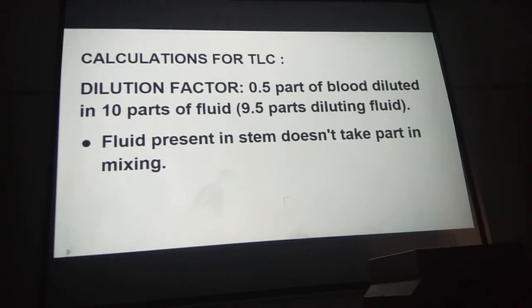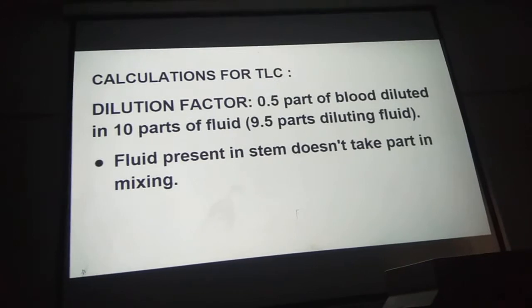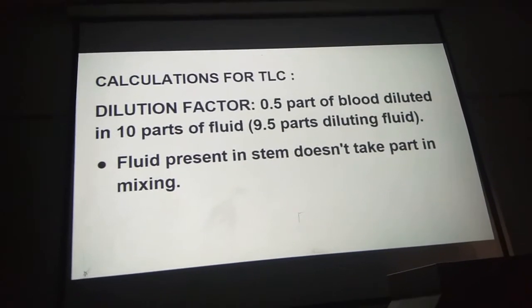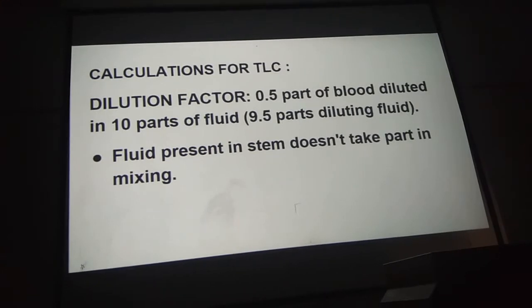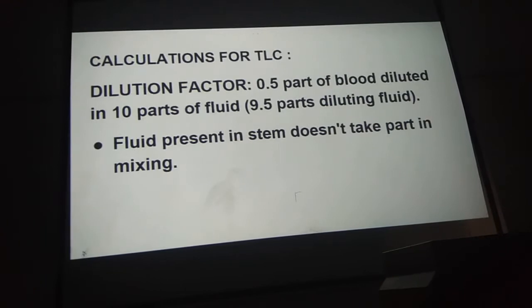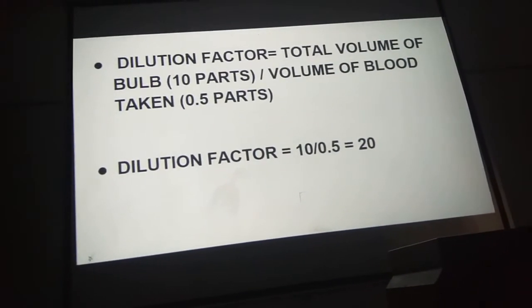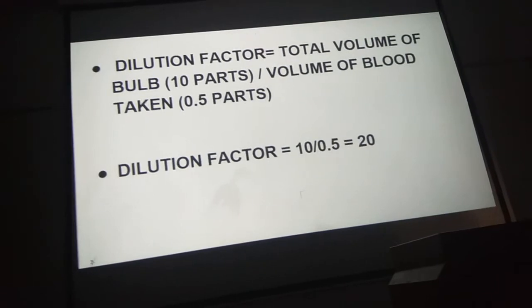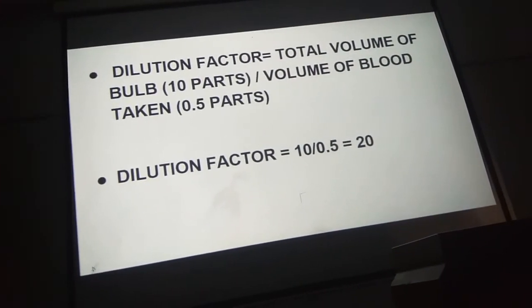We took the blood in the WBC pipette up to mark 0.5 and then took the Turk's fluid up to mark 11. So 0.5 parts of blood is diluted in 10 parts of fluid, or 9.5 parts of diluting fluid. The fluid present in the stem does not take part in the mixing. The dilution factor is calculated as total volume of bulb (10 parts) divided by volume of blood (0.5 parts), giving a dilution factor of 20.